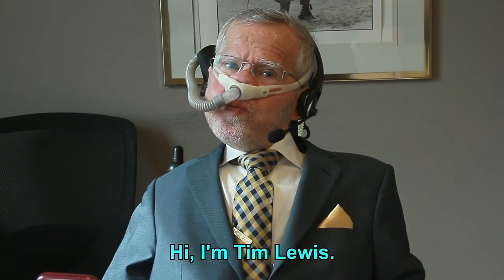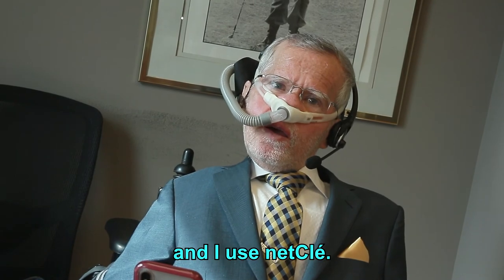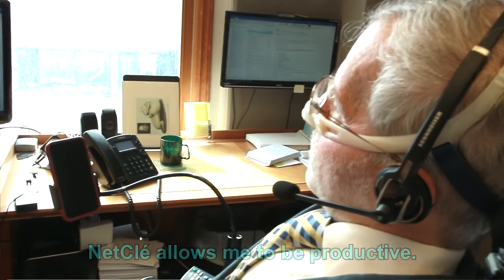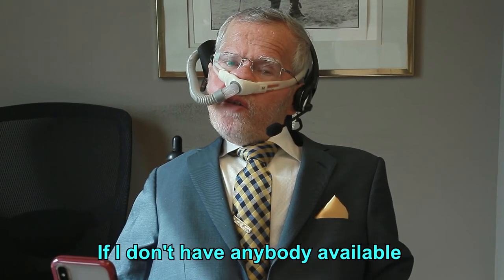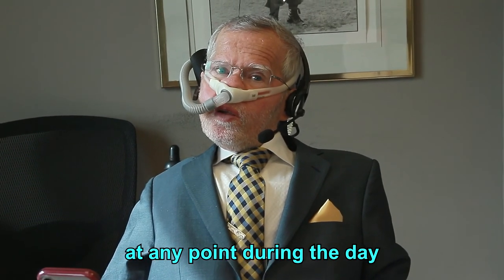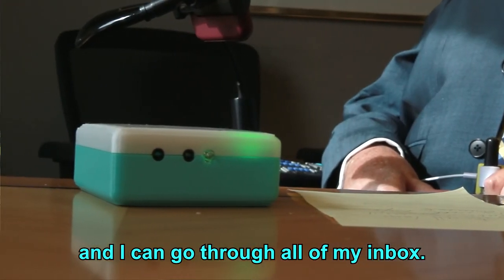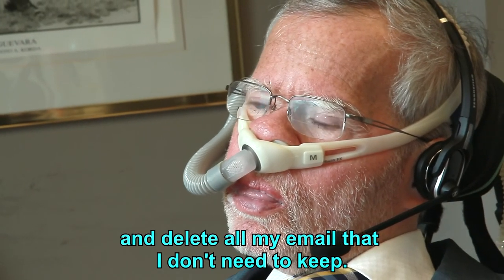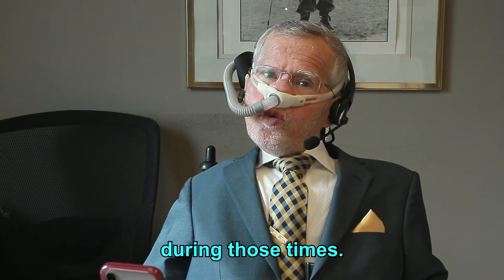Hi, I'm Tim Lewis. I'm a disability rights advocate, and I use netClé. I get a lot of emails — maybe a hundred in a day. netClé allows me to be productive if I don't have anybody available to keyboard and mouse for me at any point during the day. I get set up with netClé and I can go through all of my inbox, open up and read it, and delete all my emails that I don't need to keep. netClé makes me independent and productive during those times.